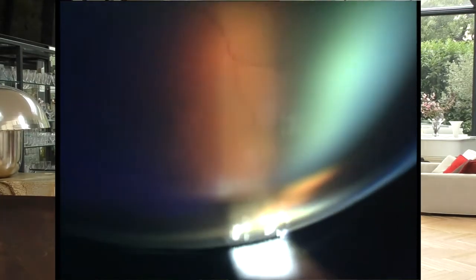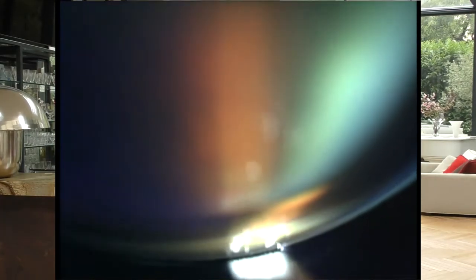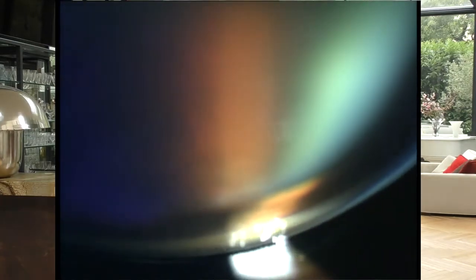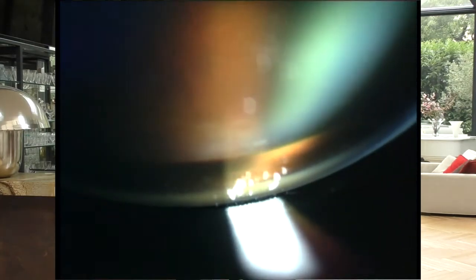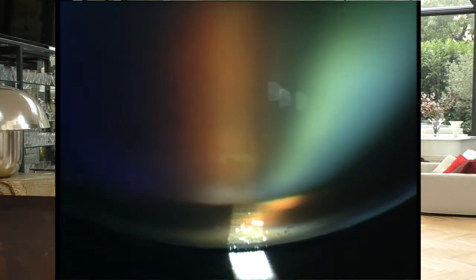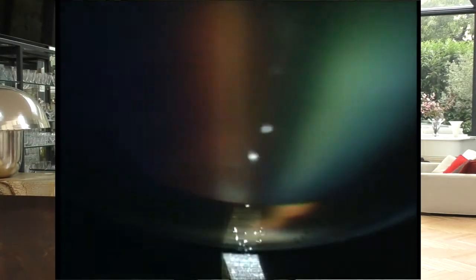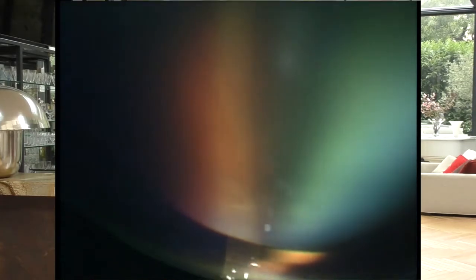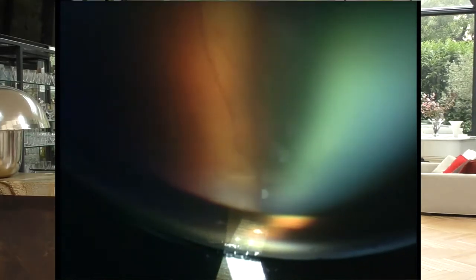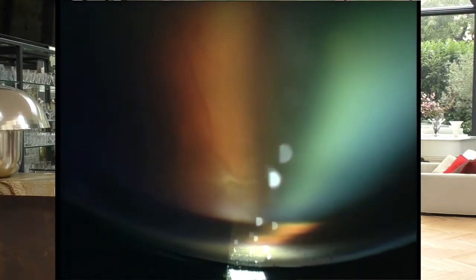But the tears are identified with less security because they are located at the limit of the exploration field of the lens. It would be hard to identify so exactly the 5 tears seen earlier. On the other hand, we always benefit from the progressive examination millimeter by millimeter.